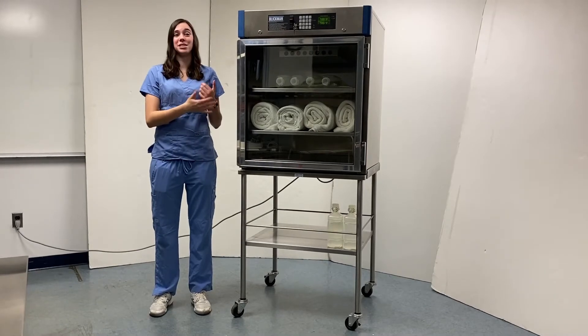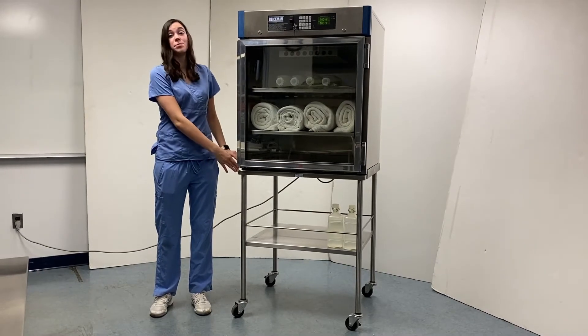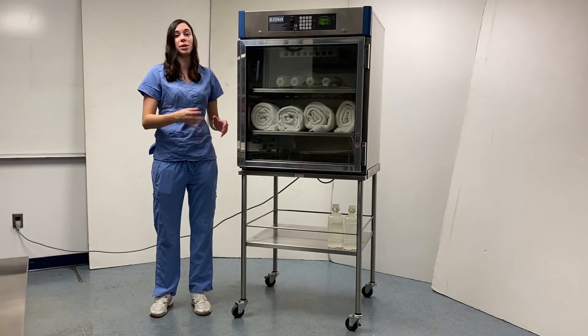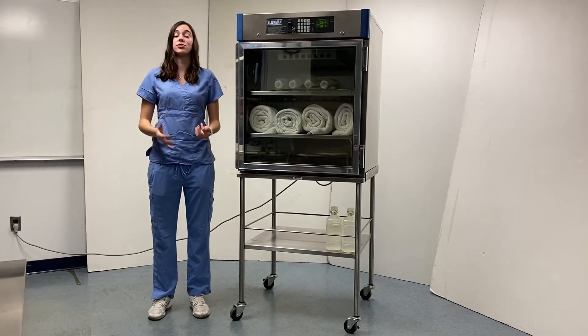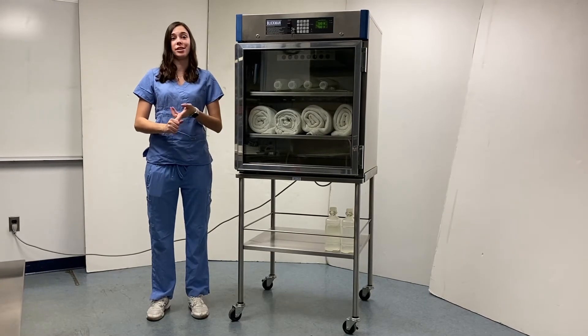Our tabletop warming cabinet today is featured on a mobile stand specifically designed to transport Blickman's warming cabinets that are designed for tabletop use. It's made of all stainless steel construction that's both durable and easy to clean.